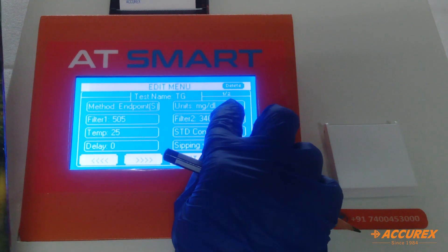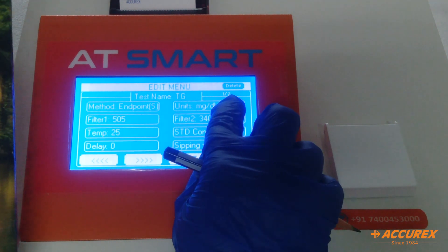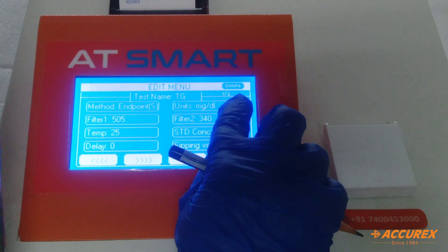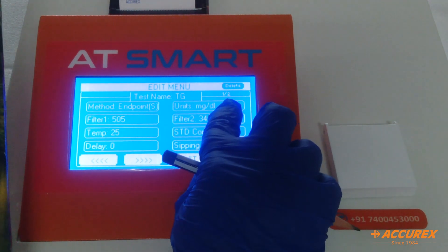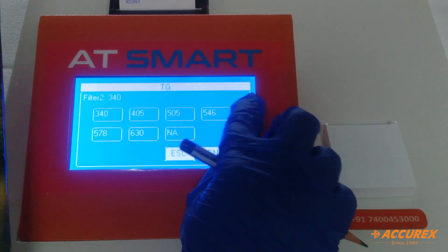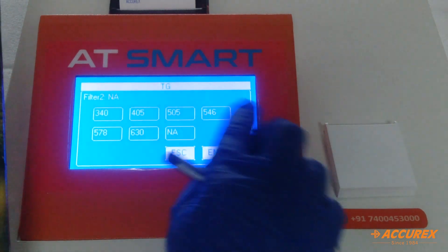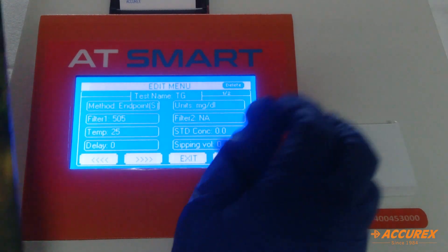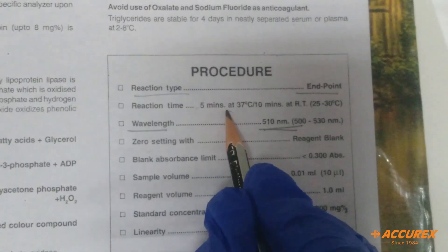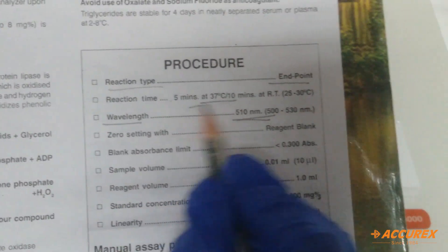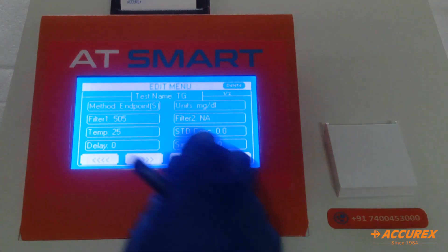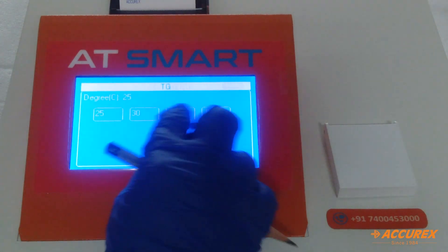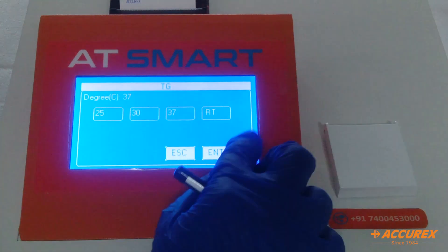For Filter 2: because TG is an endpoint method, Filter 2 is not applicable — press NA and enter. For temperature, set it to 37°C, so select 37 and enter.